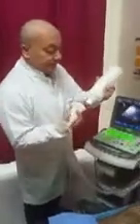And in an unstable patient, a patient with hypotension, after I examine the peritoneum in the abdomen, and also after I examine for pericardial tamponade in the heart, whether it is present or not, I want to check another disease that can cause hypotension in the patient, which is pneumothorax.